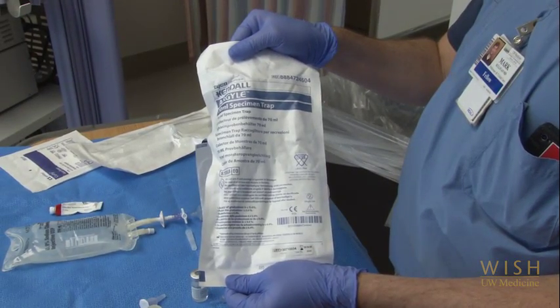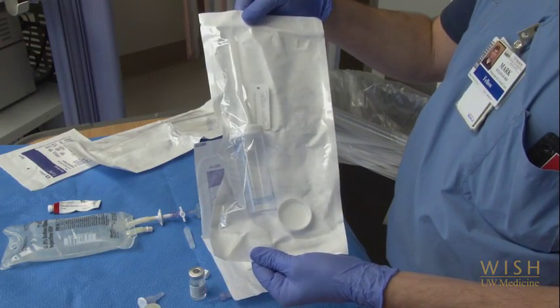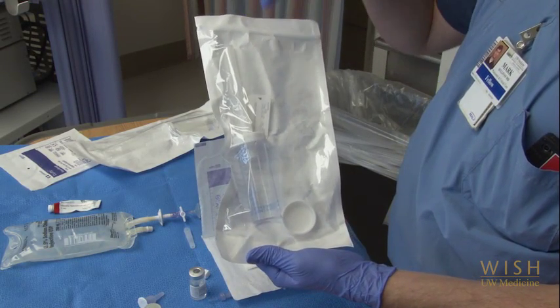Next, prepare your specimen trap. It's helpful to open the trap and apply a patient sticker before you start the procedure. We have had cases of specimens lost for want of a patient sticker because this was left to the end of the procedure when everyone was busy and the step was missed.